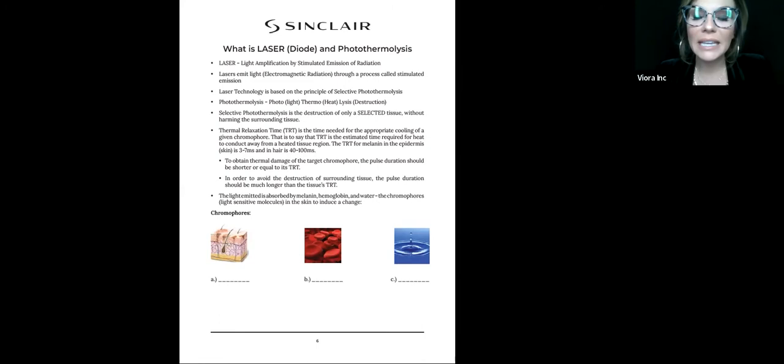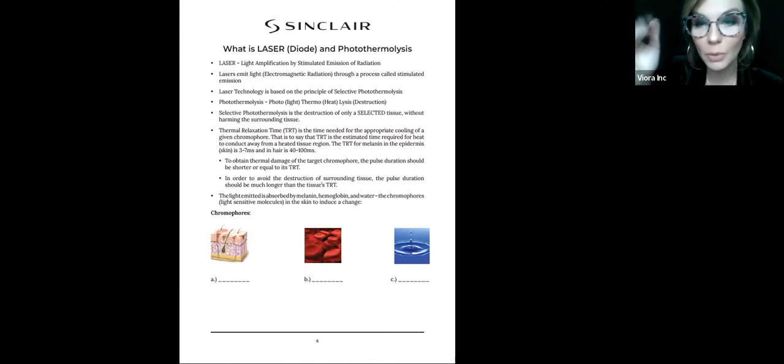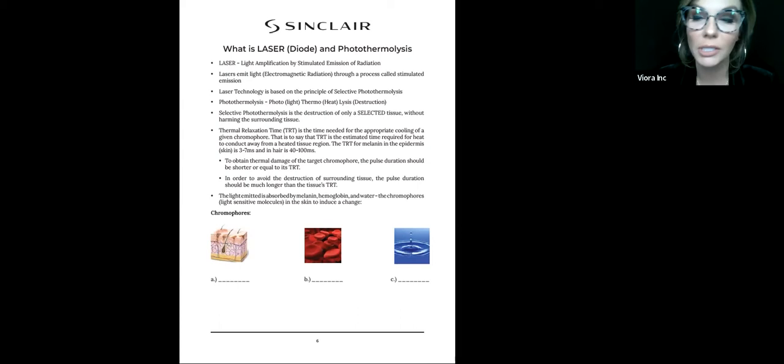So that being said, on this page, I like to just bring up how important TRT is, how important it is to understand. But when I get to the page of talking about pulse duration, that's when I'm going to really break it down more. So I'm going to skip over it right now, and then we'll talk about it in just a couple pages. But I do want to talk about chromophores.